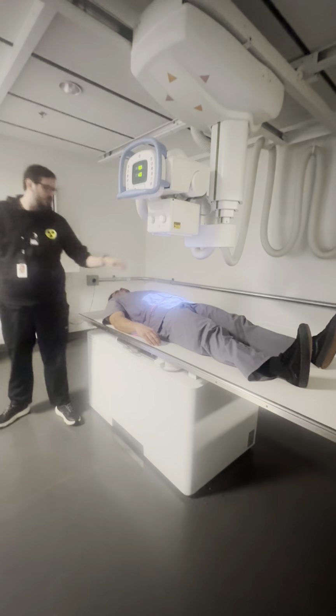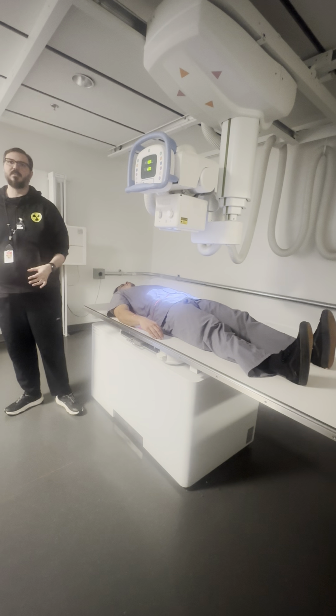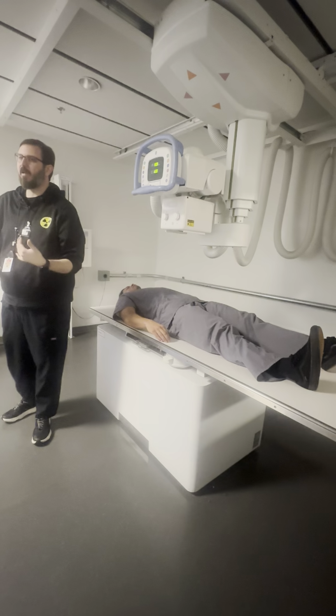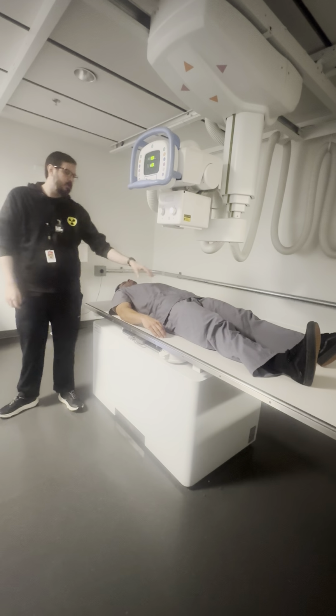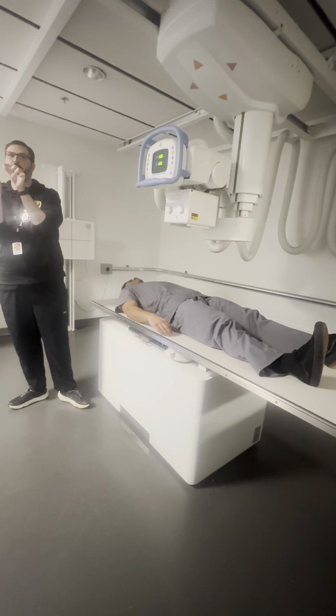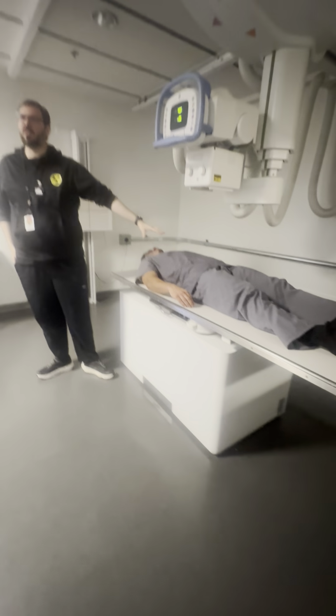I've had patients where it just sits in that stomach the whole hour and it never slides down. So instead, this is where you have to use your brain a little bit, because you can't just assume at 30 minutes it's going to be there. So you take your initial and go, okay, it's mostly in the stomach and I'm starting to see it trickle into the duodenum. I'm not going to go down for my 15 minute, I'm going to stay high.